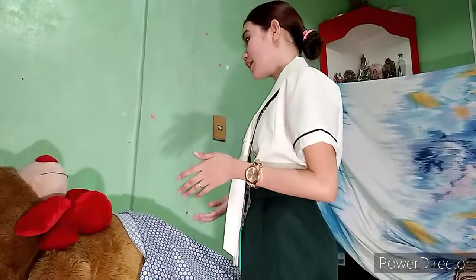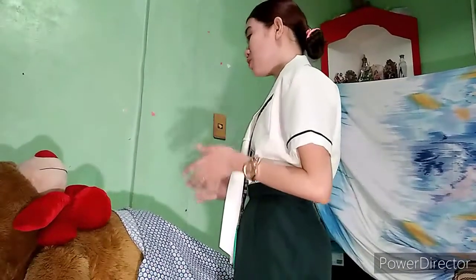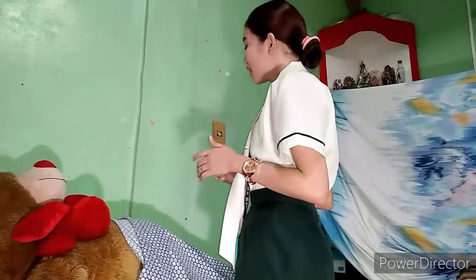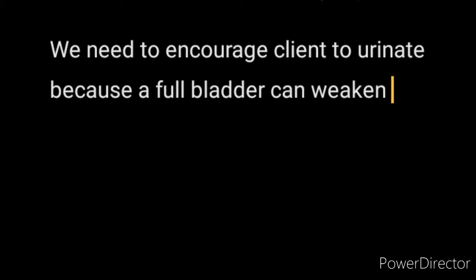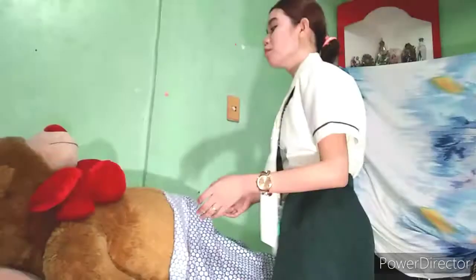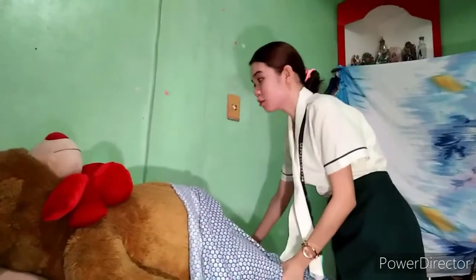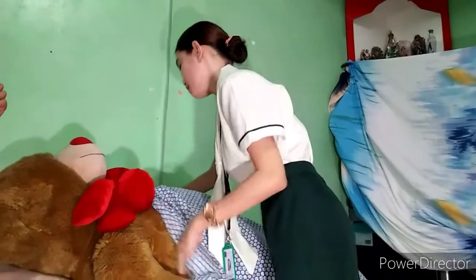Ma'am, if you can stand up to urinate to the bathroom, I will assist you. But if you feel dizzy, I can offer you a bedpan or I can insert a catheter that will help you to urinate. Encourage the client to urinate because a full bladder can weaken contractions and delay the separation of placenta. Ma'am, I will assist you to lie down on bed with your legs apart. And I will drape what is not needed to be exposed.